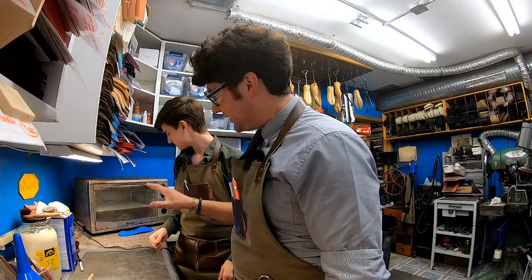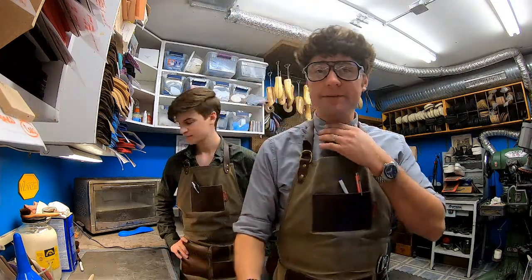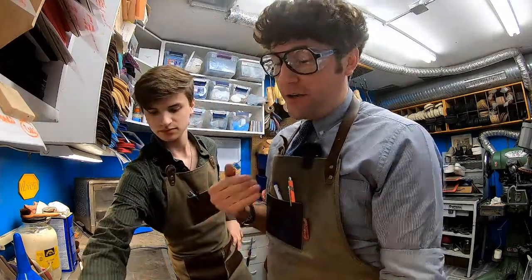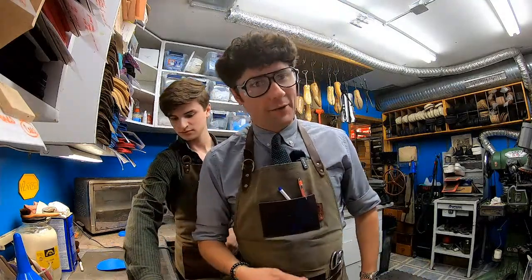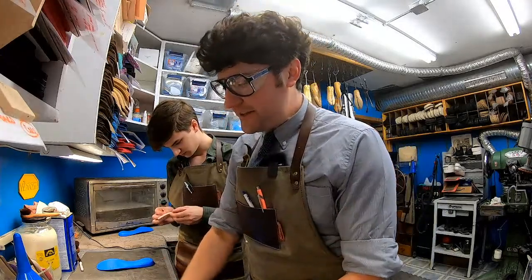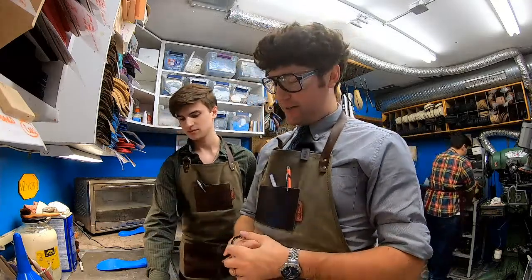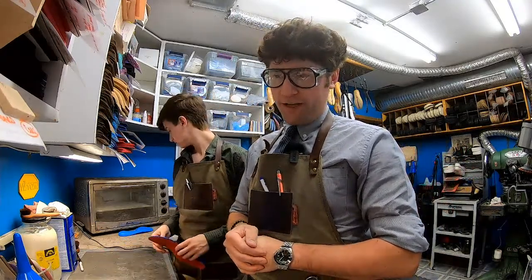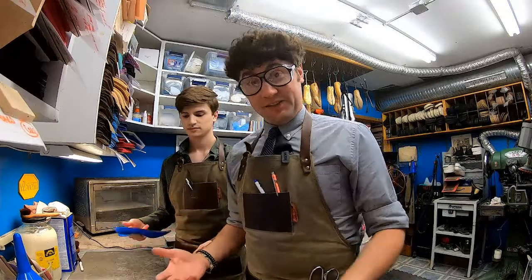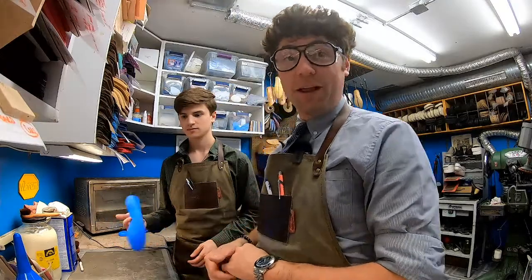So we're gonna let this glue sit for a minute. Again, right side is happy. She hasn't been overcompensating. She doesn't have any additional issues. I asked about knees and hips. Her youngest child is 2 years old. This kind of all started around that same time period. Blame it on the kids, right? But that's not uncommon. Women, changes in hormones post-pregnancy or during pregnancy. A lot of times we get people that have some kind of soft tissue implications when it comes to the feet. They're getting back into work, taking 20,000 steps a shift at Menards, which will certainly put a lot of pressure on the feet.